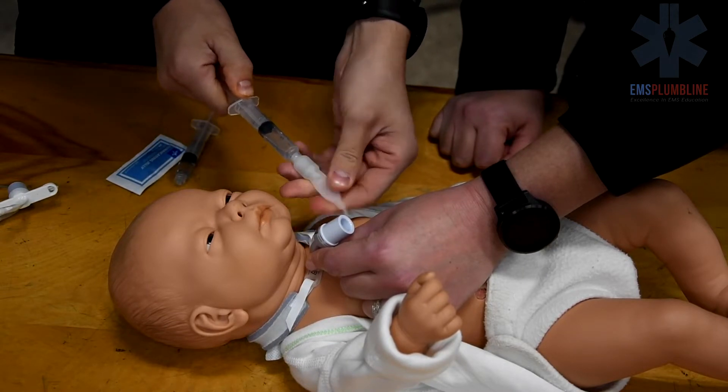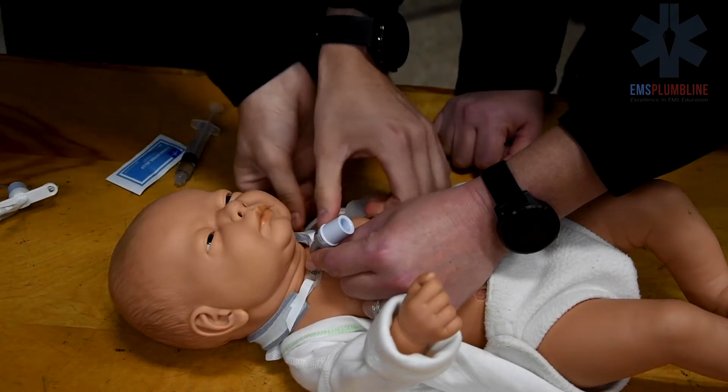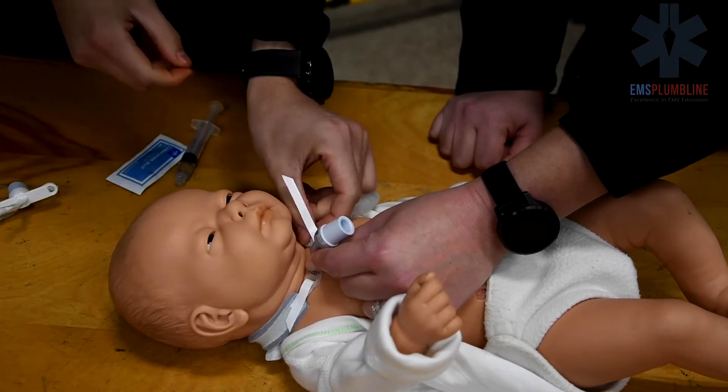Remove the volume of the trach cuff if applicable. Remove one side of the trach ties.